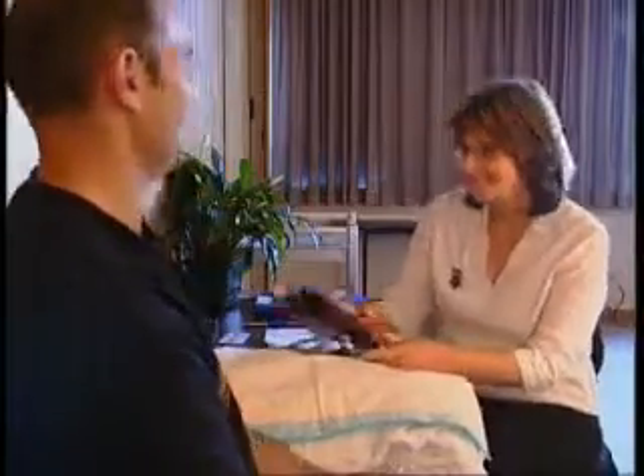That's great — it's 120 over 78. That's very normal for someone of your age. Remove the cuff. Return the client to a comfortable position and assist to adjust clothes as necessary. That's a good blood pressure for your age. Are you aware how often you should have your blood pressure checked? No. So it's recommended that you have it done every five years, and when you get to 40, every three. So if we don't need to see you before that, I'll see you in five years' time to do your blood pressure check. Thank you. See you.